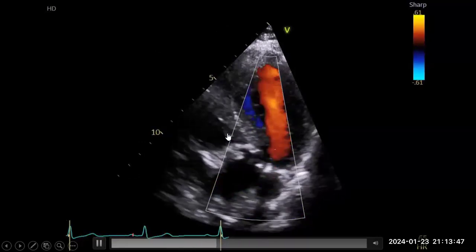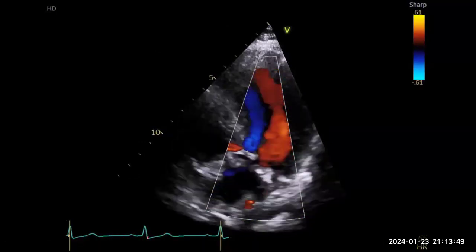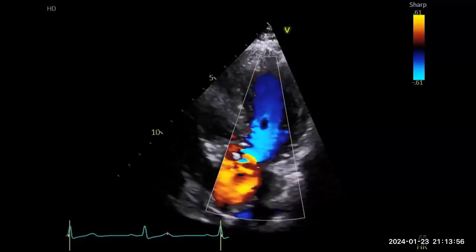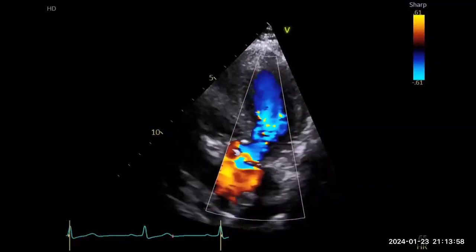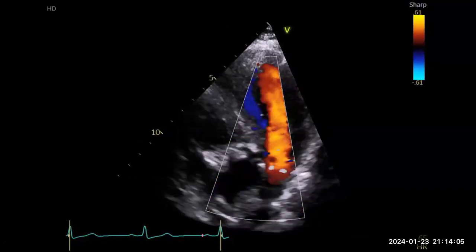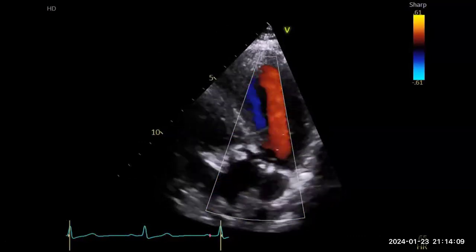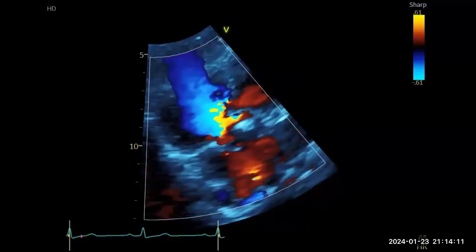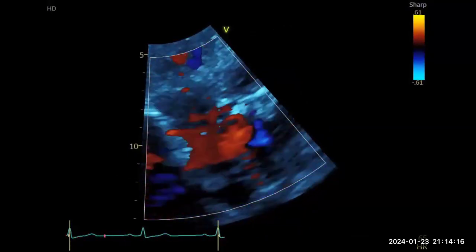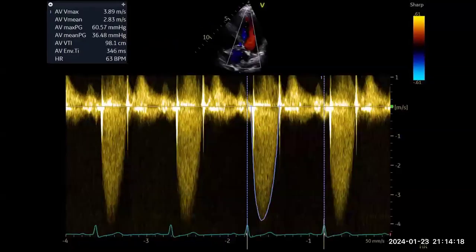This is looking at the LVOT and aortic root. What you notice here is color aliasing, and I think it's just turbulence. I'm not sure. I don't see any specific regurgitation. Okay, at least there's significant turbulence starting from the LVOT and going to the aortic valve. Am I right? No. This is the next, three-chamber again. You have flow acceleration with turbulence and aliasing at the aortic valve.